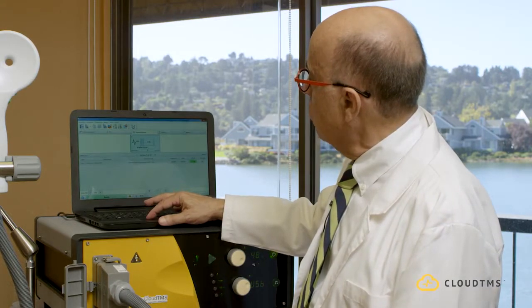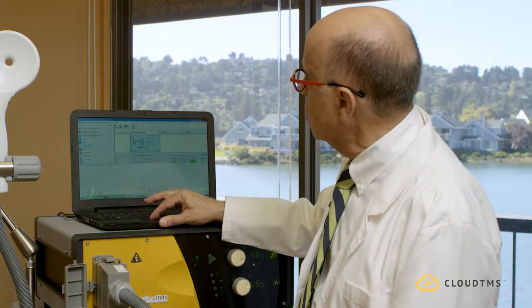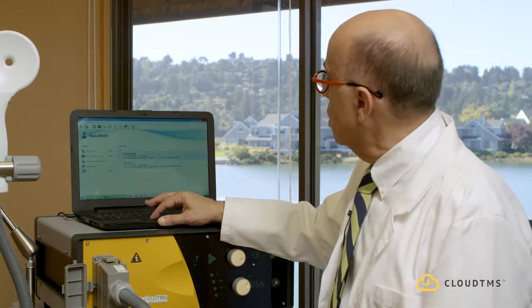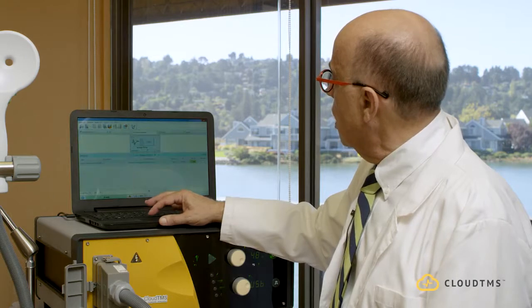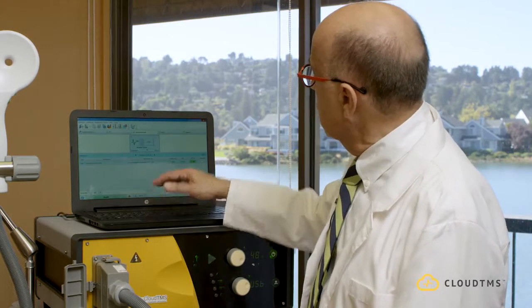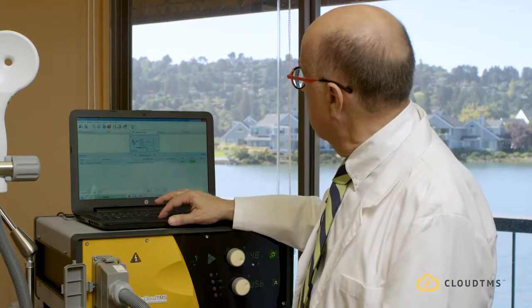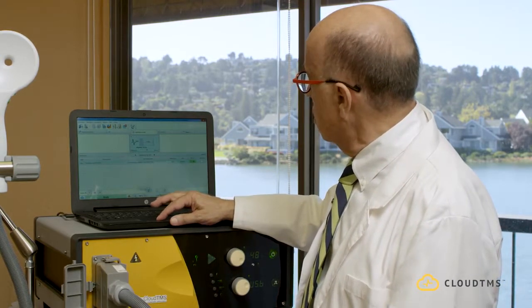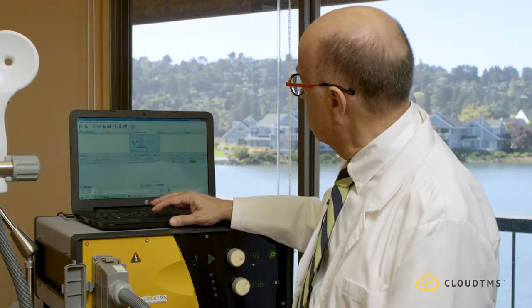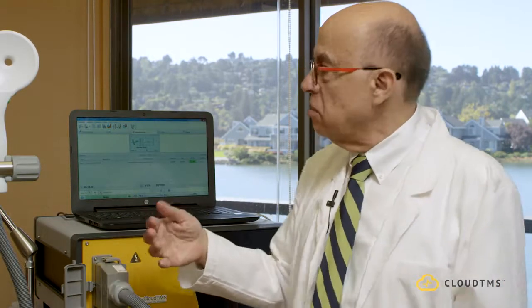The next time the patient comes back in, I'm going to close that, and let's say I'm saving that treatment. Let's say the patient came back in the next day, and you see it says session 2. Again, it's still going to do the 19 minutes protocol. So I say this, and I say yes, I've placed it. And now it's going to do it again.